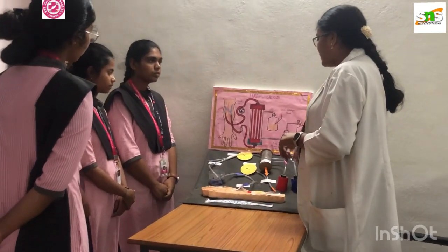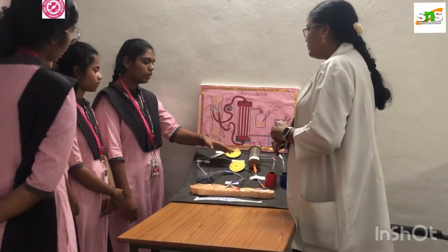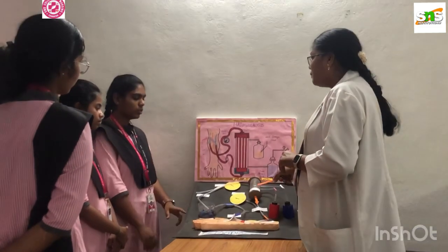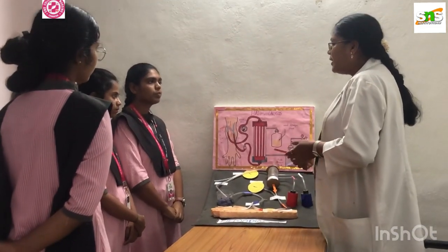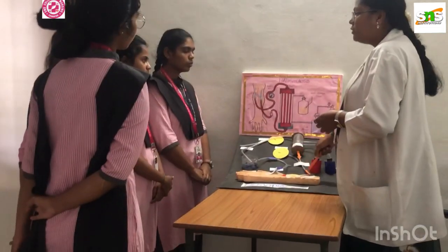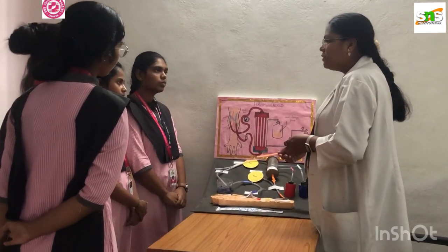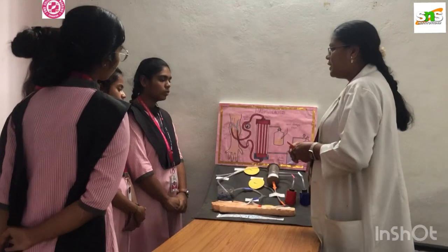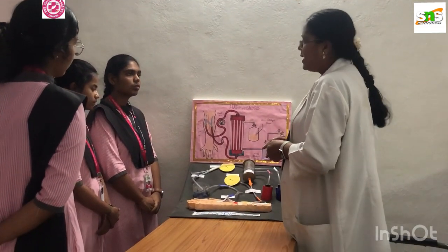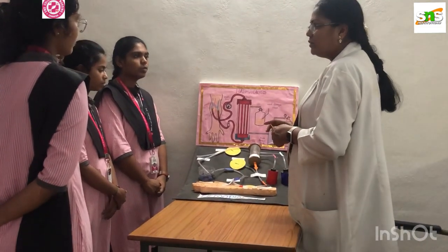Darshini, can you tell me what the role of a dialyzer is? The dialyzer is a filter. It will filter all the waste products and provide the purified blood which normally comes out from a kidney. The blood will be pumped out of the dialyzer similar to the blood which comes out of the kidney, and the waste fluid will be excreted out. The role of removing the waste products is done with the help of a dialyzer machine. This is the complex process of dialysis. Any doubts? Thank you.